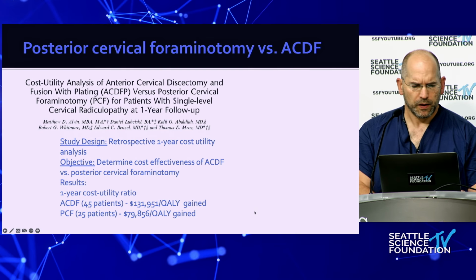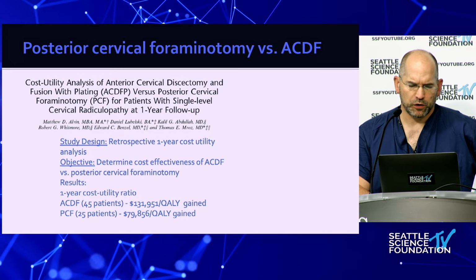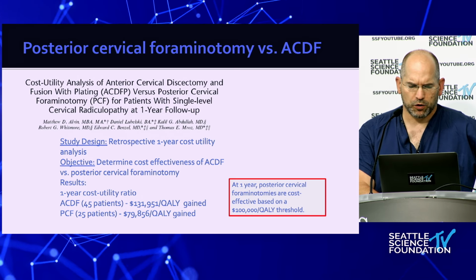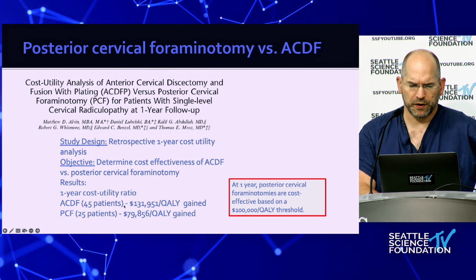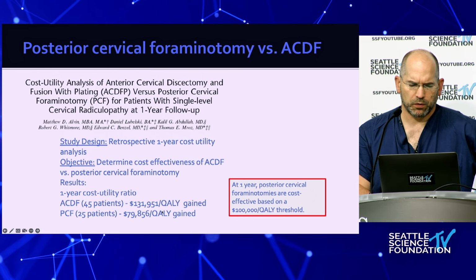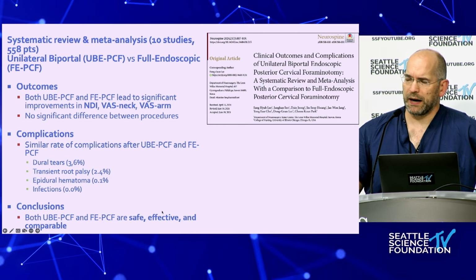So they're durable. And here they looked at price and cost effectiveness, and it actually showed that they're quite cost effective compared to ACDFs because you don't have to pay for all the implants and all the other stuff. What about biportal, right?